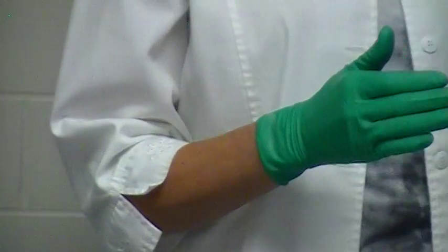And at this point in time, I would be ready to put my tape on here. Now, your tape is not sterile, so technically your sterile technique is done at this point in time. However, if you refer to your book, it wants you to put the tape or Montgomery straps on with your gloves on. Okay, so beware that it will probably stick to your gloves.